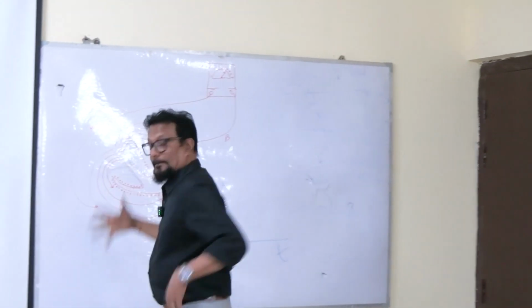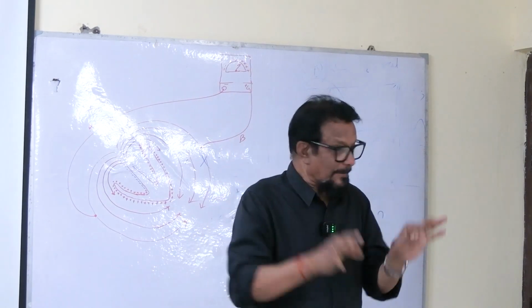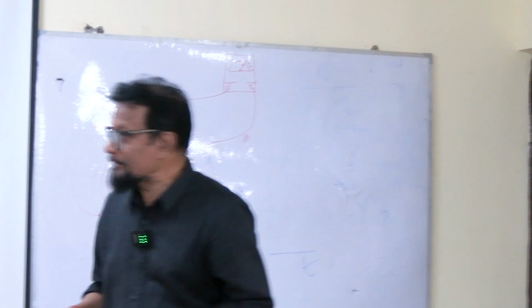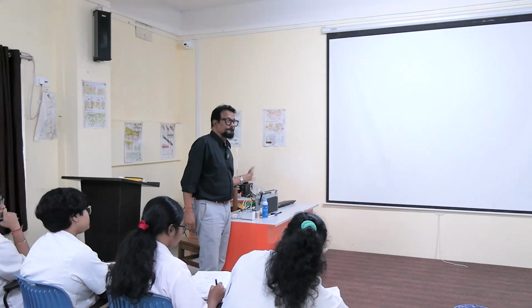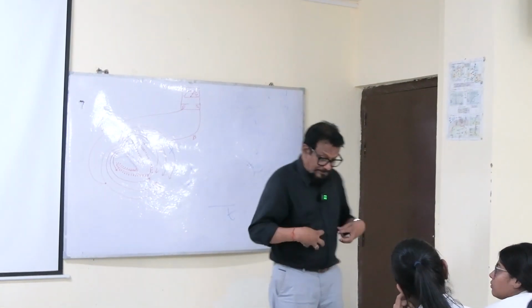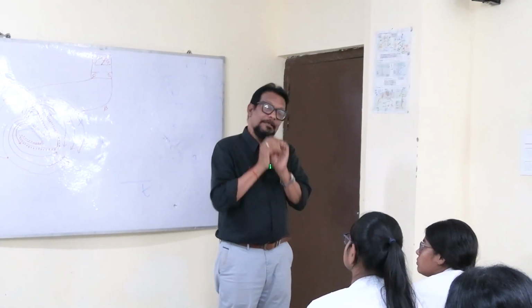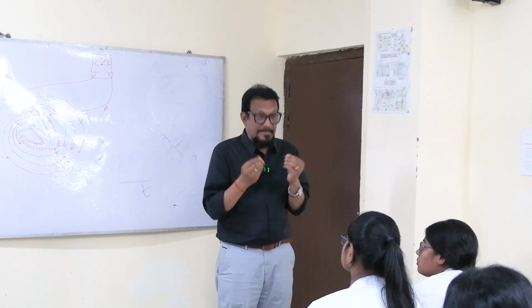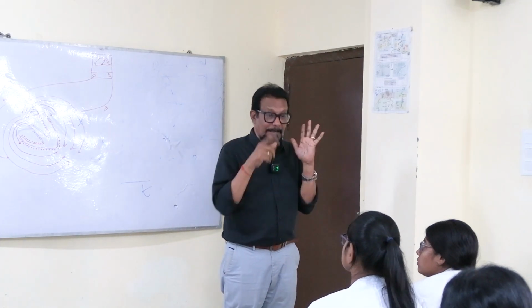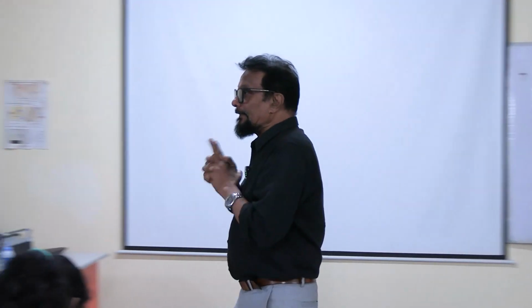Now, how will you pick up this current? You have to pick up this current, and for this what do you need? Different electrodes. So these are the electrodes, different wires. A lot of wires. Now, to record this electrical activity with these electrodes, we use a system called the lead system, L-E-A-D. We call it the lead system.